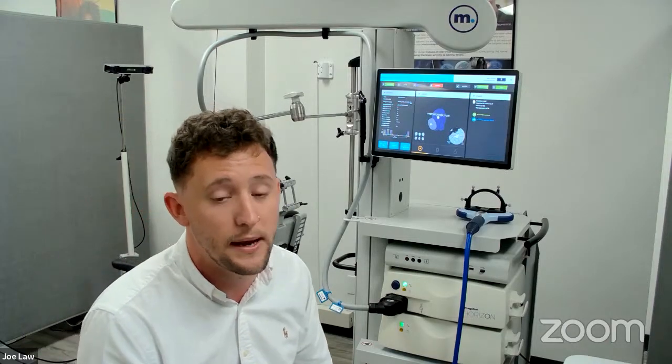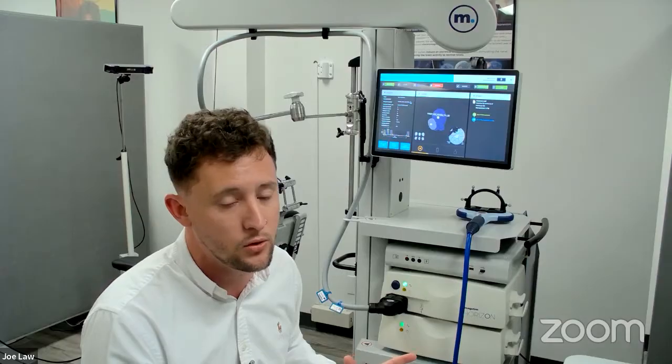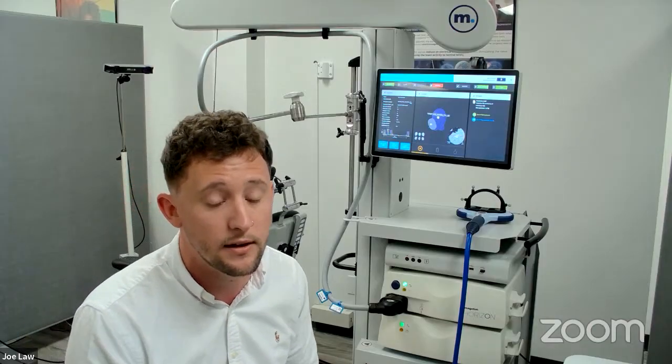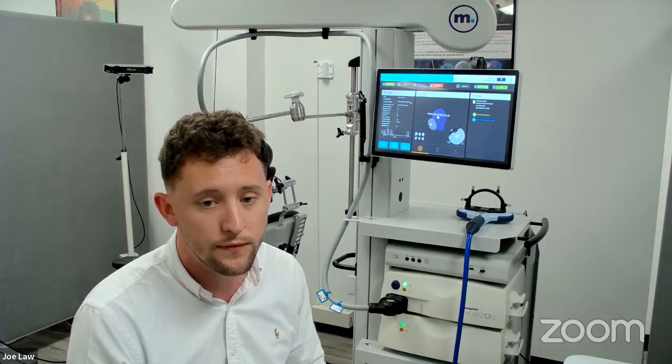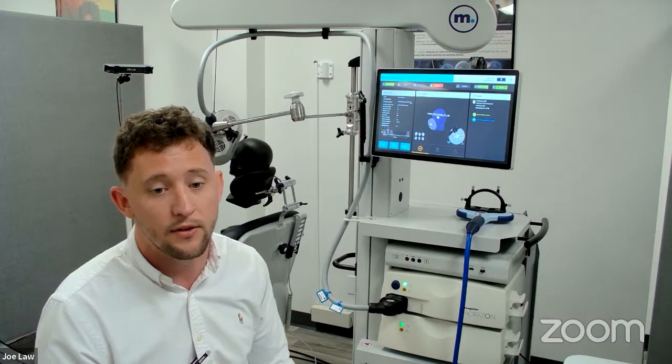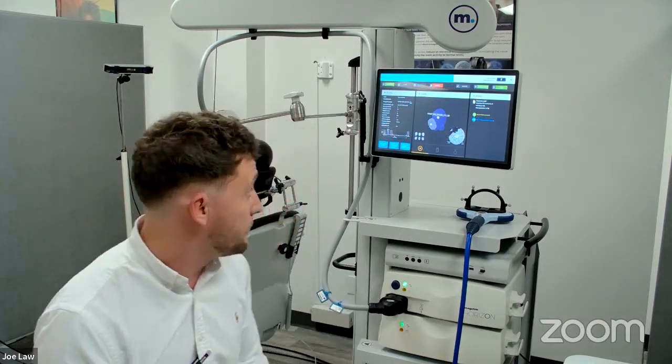So one of our clinical specialists will come install the system at your clinic, and then you'll have 2 days of clinical training with our clinical specialist, just to make sure you're fully up and running and know how the system works. We don't generally leave there until you're fully satisfied and happy with how the system works. But that will be the full workflow.